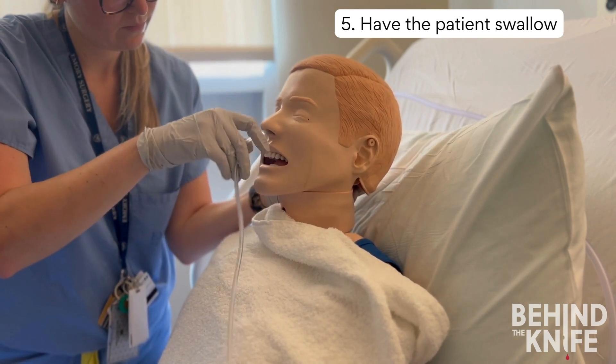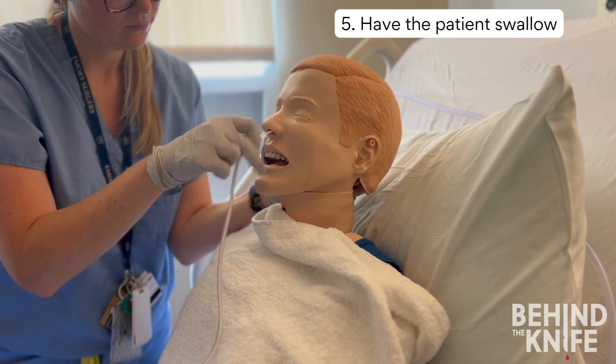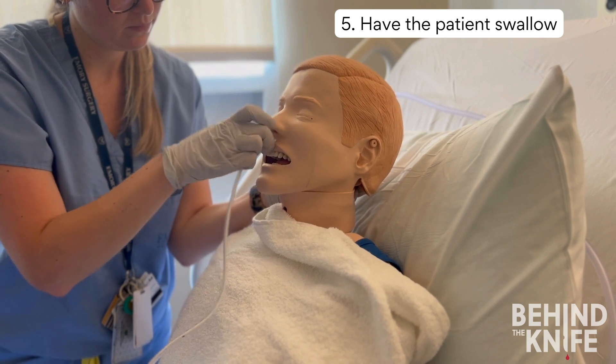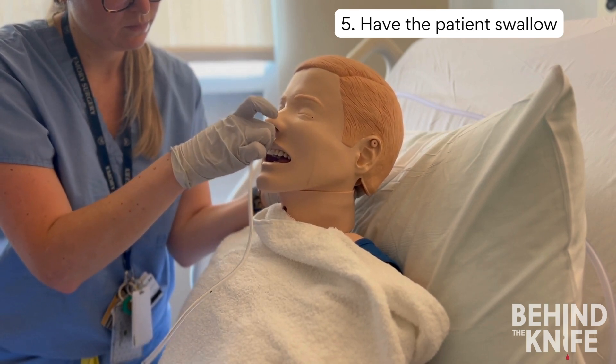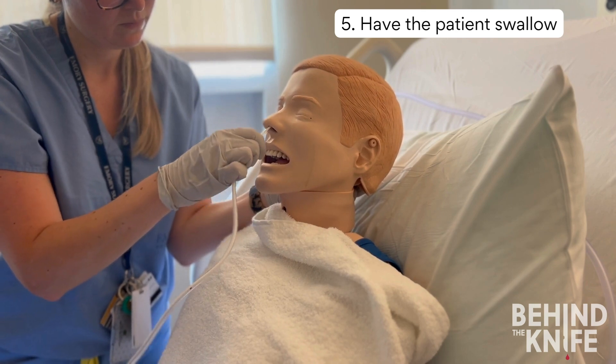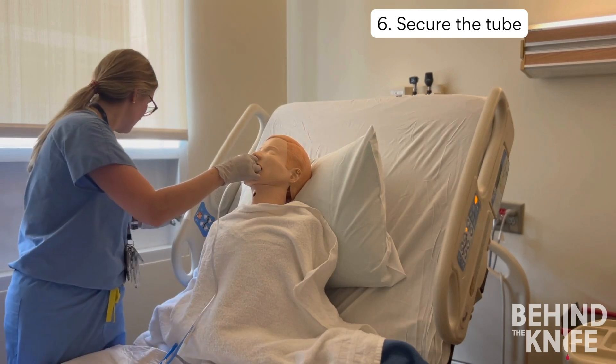Sometimes having the patient drink water through a straw can be helpful, but it is not required. The tube can get slippery as you advance. I like to use my thumb and first finger to advance and my other three fingers to stabilize the tube. As you are advancing and repositioning your hand, make sure to never fully let go of the tube, as it could slide out of the patient's nose. Continue advancing until you reach the depth you previously measured.